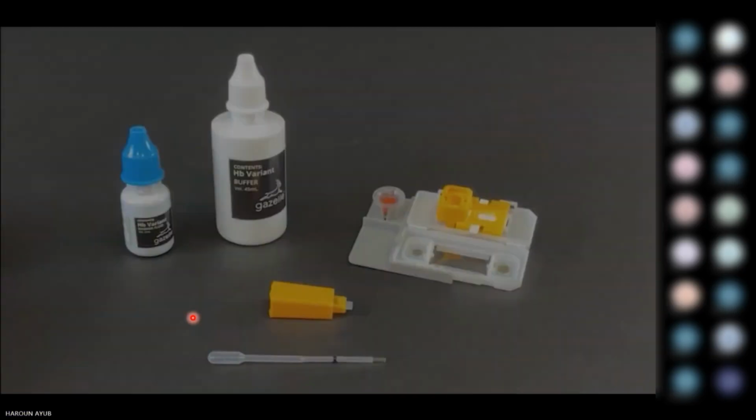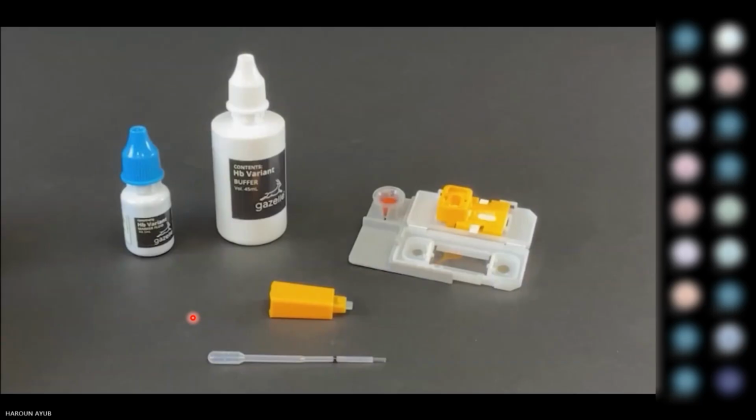So this is the new version of the kit. You'll receive your marker fluid, your buffer, and your test cartridge that is assembled, the applicator, and the collector.